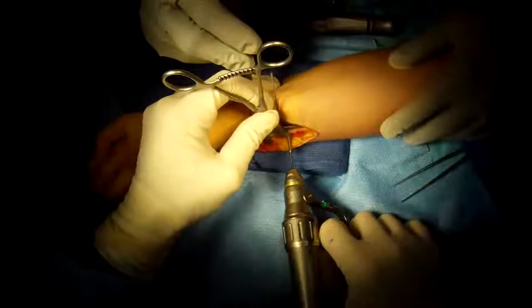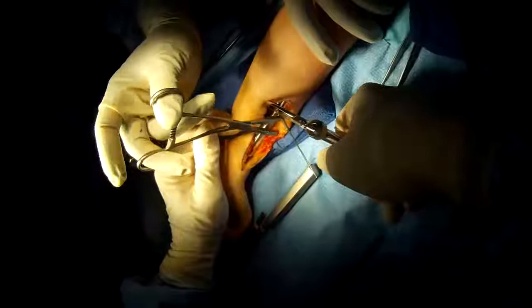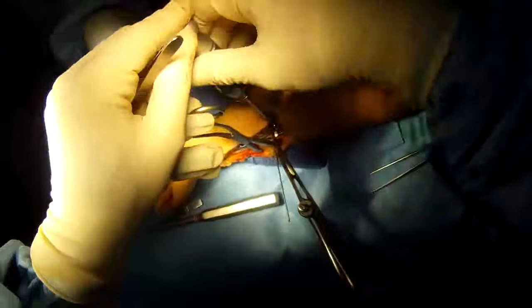That piece of bone has been removed. This special clamp attaches to the plate, and we're attaching it to the bone on the other side with a K-wire. We can then compress the osteotomy — remember, we removed a piece of bone — and this controls the compression.